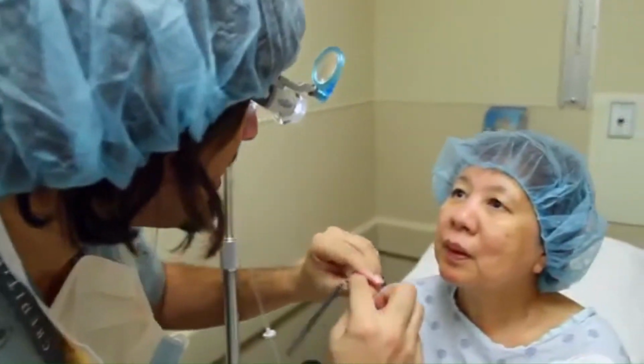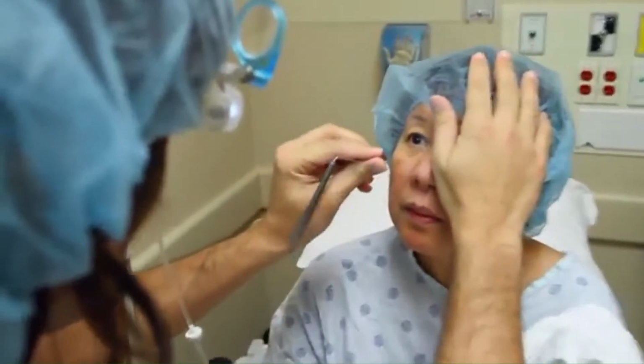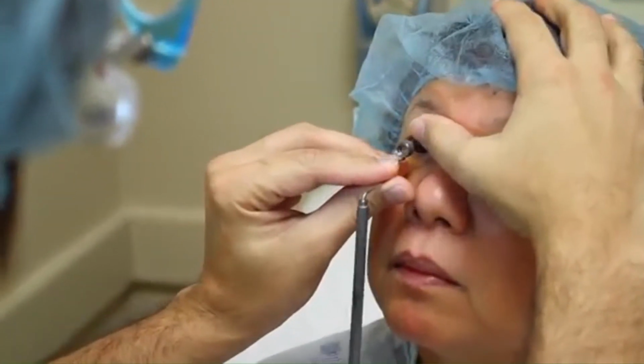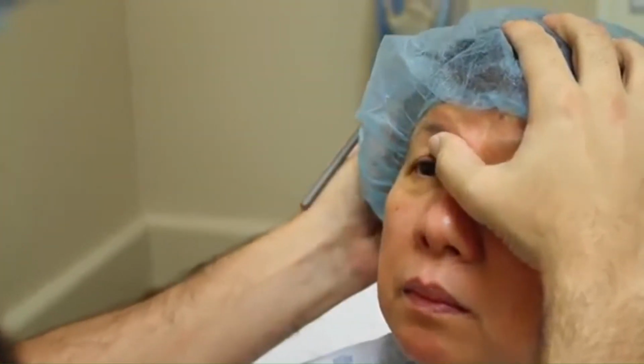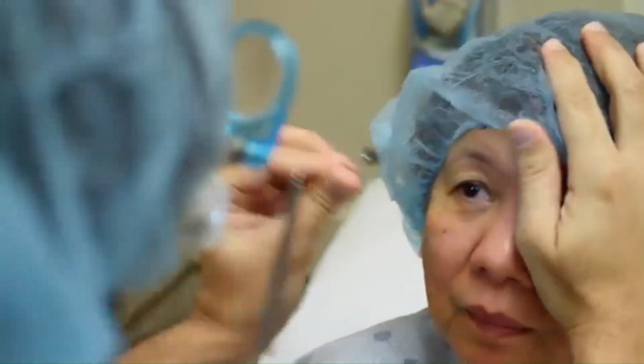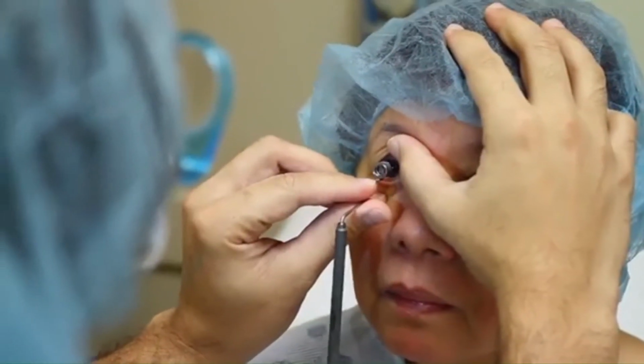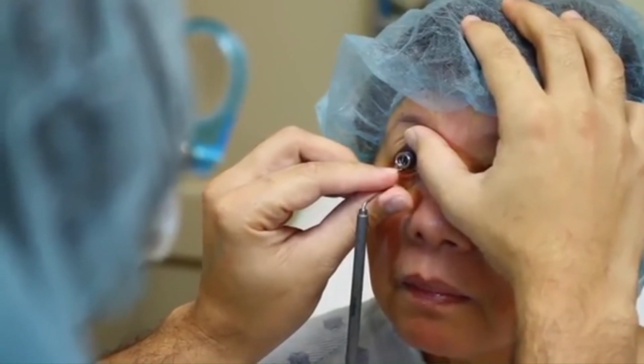Now, I'm going to look at the white light over here, okay? All right. I'll just cover this one. Now look with your right eye actually here. Yeah, like that. Good. So I'm going to come forward a bit. There you go. Keep head straight. Yes, I will.